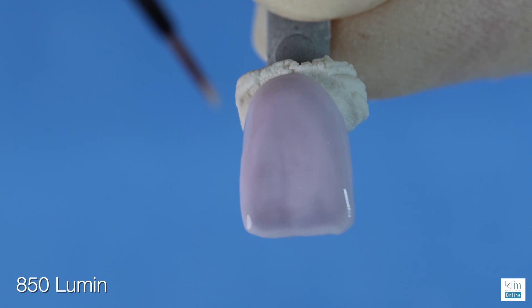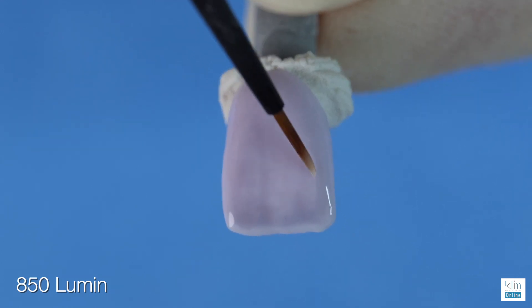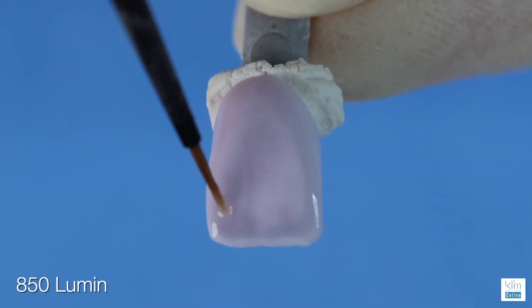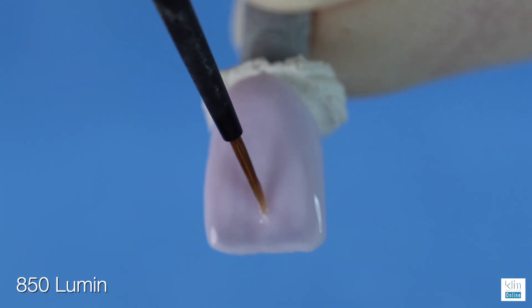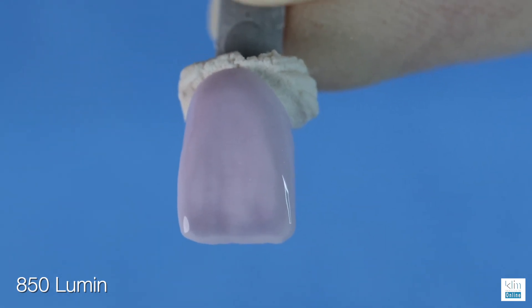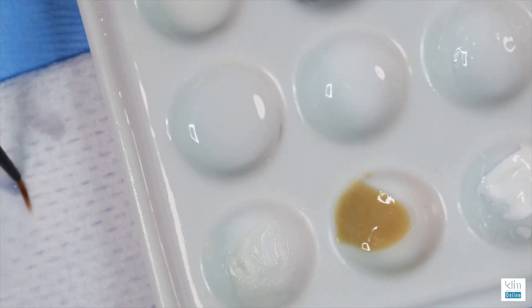Quite often on the line angles where the enamel is thicker, you'll see the enamel appear slightly higher in value — we can do that with Lumen. It is translucent so it's going to blend right into the ceramic. This will also highlight the mamelon effect. The next step for this exercise is to pick up some dentinal shade to enhance the mamelon effect.